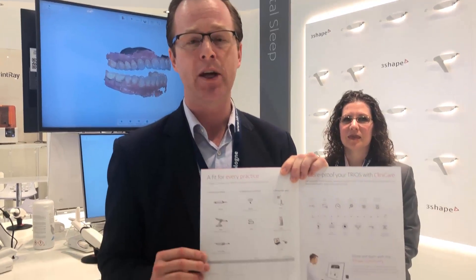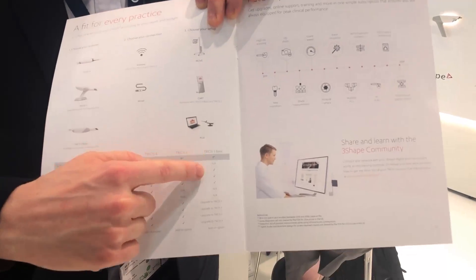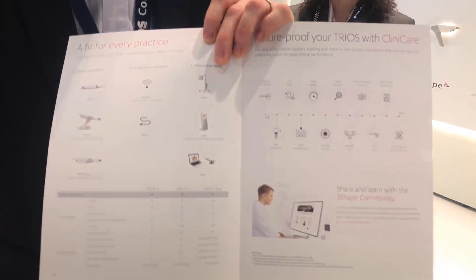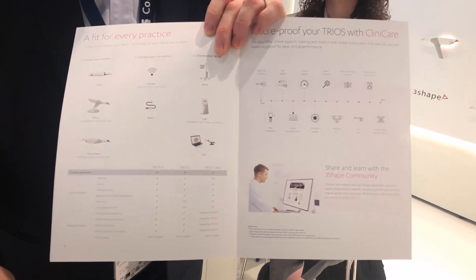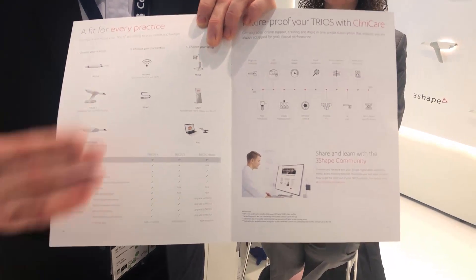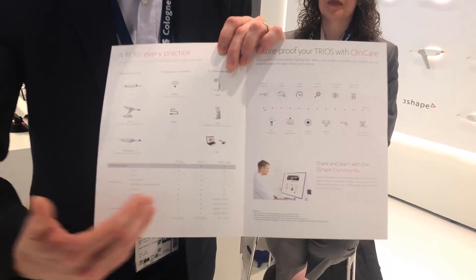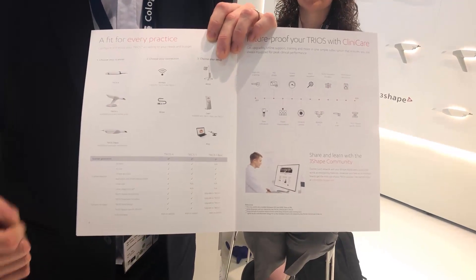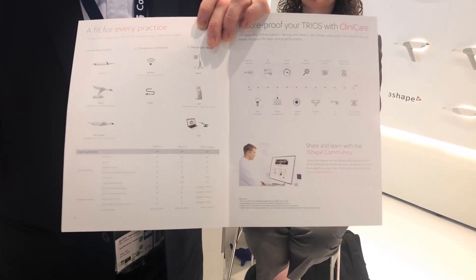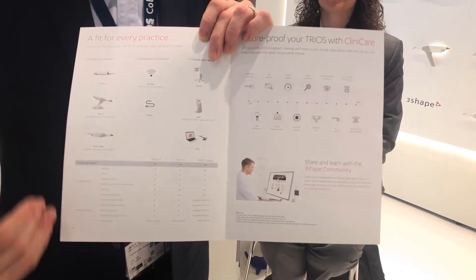There are lots of added features available here as well. One would look at something and say, 'I just want a basic scanner.' That's available — I showed that was released at the Midwinter Meeting in Chicago, with a $23,500 entry price, an entry scanner that you could then upgrade. You could upgrade to app integrations and different software features available for the clinician, the laboratory technician, etc. You can always change that.